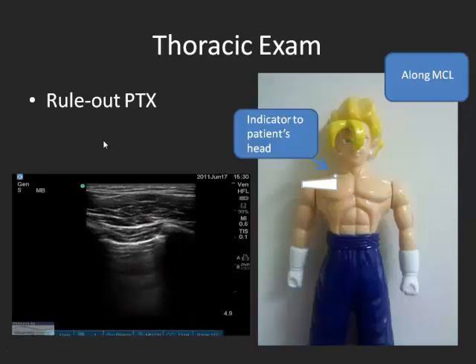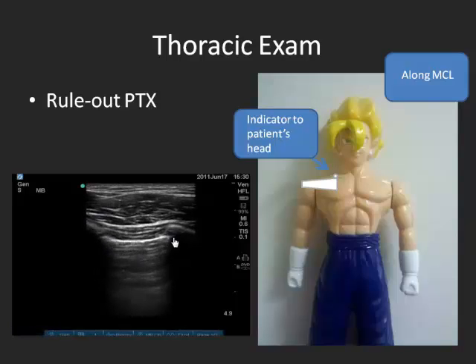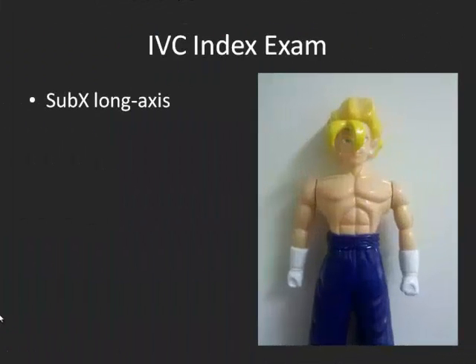When you have a patient breathing, you can see all these little elements moving and sliding — we call that the marching ants. The IVC index exam is actually a sub-xiphoid long axis view. You can take your probe, put it longitudinally, go sub-xiphoid, and then pan over to the right side of the patient until you see this big black blood vessel, which is your IVC.